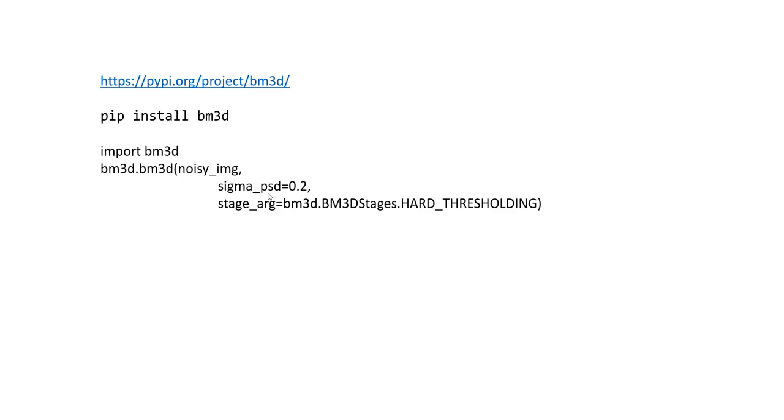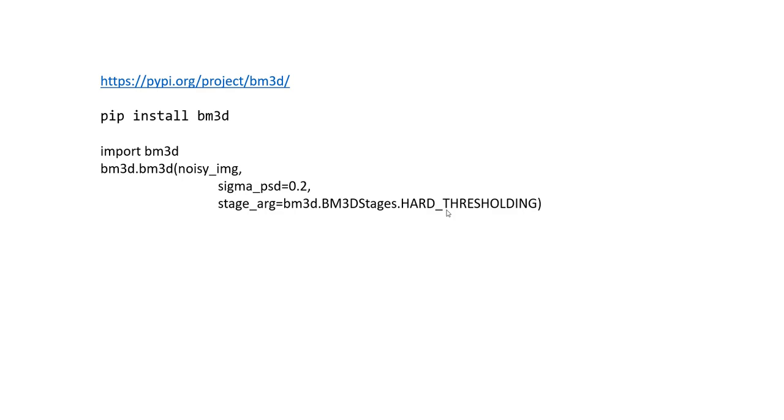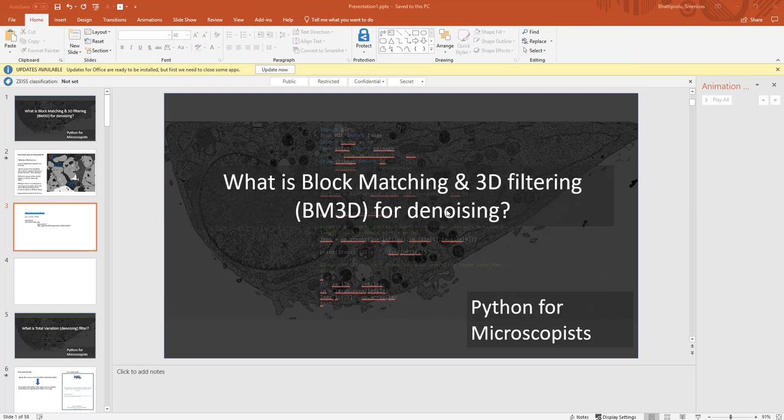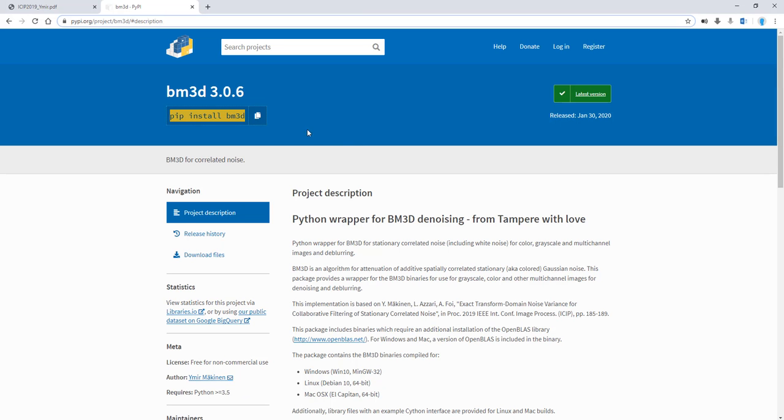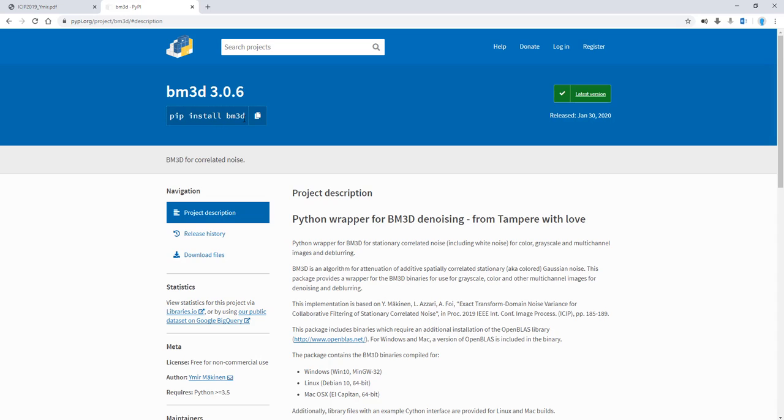From BM3D, import the function BM3D and then apply it on your noisy image. You can define your sigma, the standard deviation there. You can also define the stage_arg, which is basically defining whether you want to do hard thresholding or all stages, which is a bit slow but powerful. By the way, all stages performs both hard thresholding and Wiener filtering.